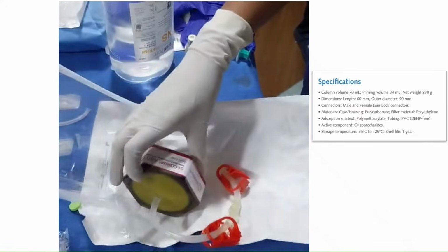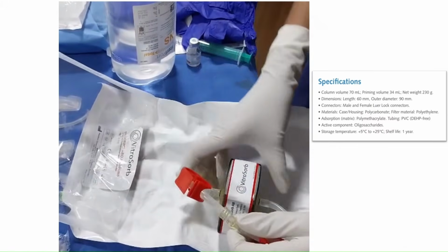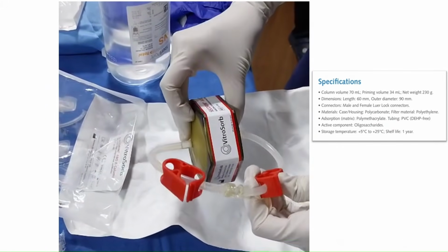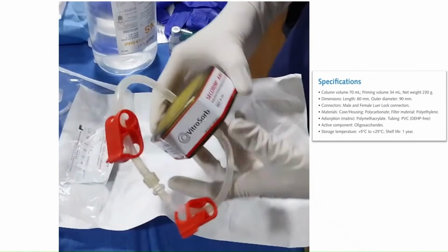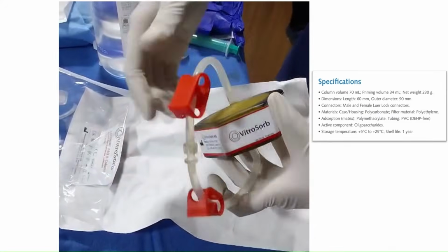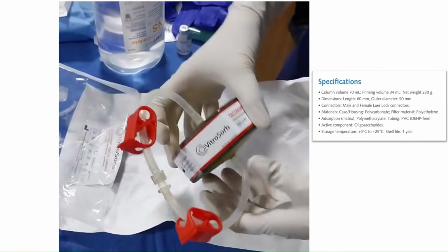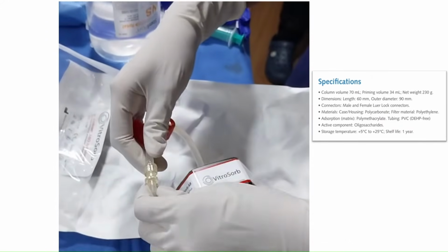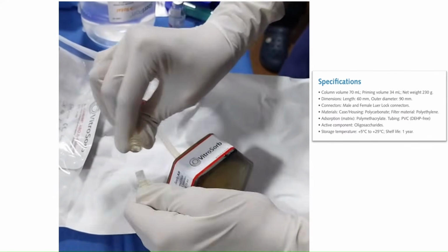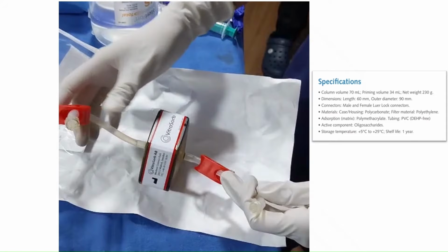This column volume is around 70 ml with a net weight of 230 grams. It has 2 connectors, male and female lock connectors. We have clamped both the lock connectors and gently open the device. The adsorption matrix here is made of polymethacrylate and the tubing set is made of PVC. The active component here is oligosaccharide and it should be stored at a temperature of 5 to 25 degrees Celsius with a shelf life of 1 year.